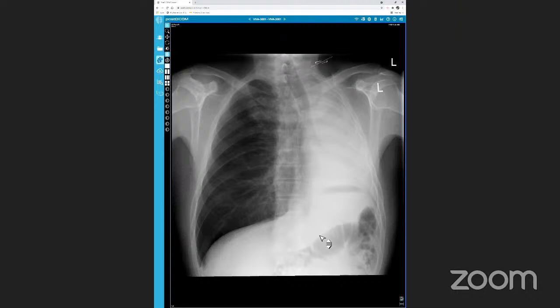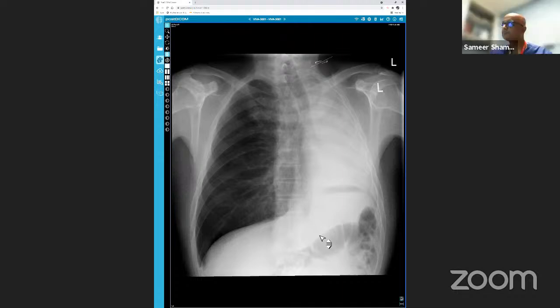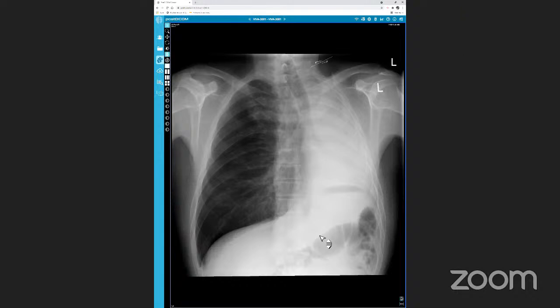So I guess I'm thinking that there is a history of surgery, maybe a left pneumonectomy. No. There's no rib which is resected. There are no surgical clips. Patient has never had surgery. I'm not sure. It's okay.